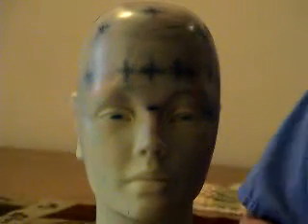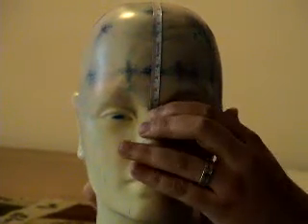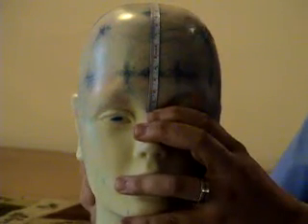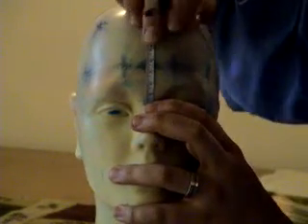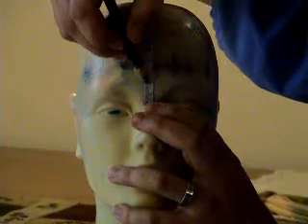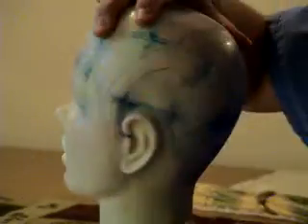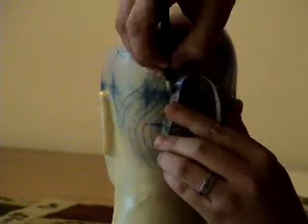First thing you want to do is take your tape measure, and all measurements will be in centimeters. We're going to measure from the nasion all the way to the inion, and this figure is 32 centimeters. The first mark that you're going to make, you're going to take 10% of that, which is 3.2 centimeters. So you're going to come up 3.2 and make a line across the tape. And in the back of the head, come up 3.2 and again make a line across the tape.